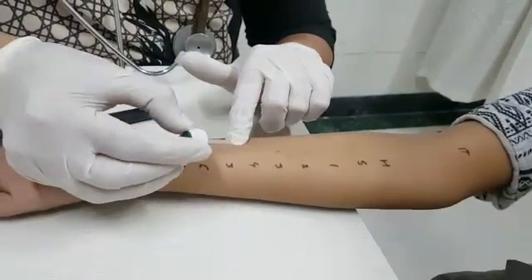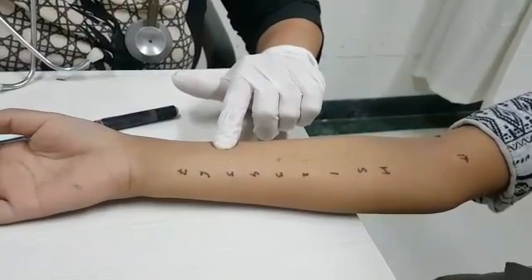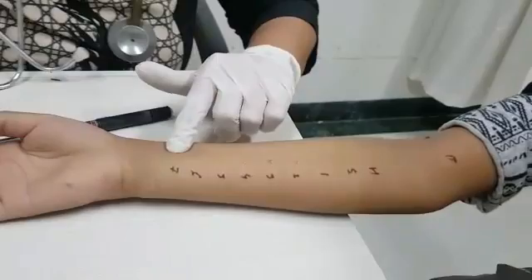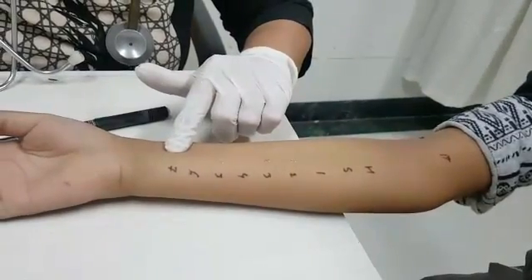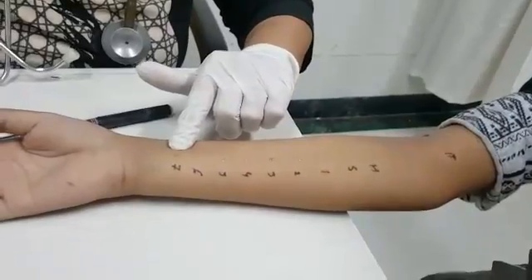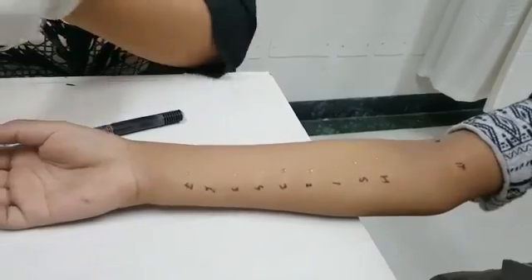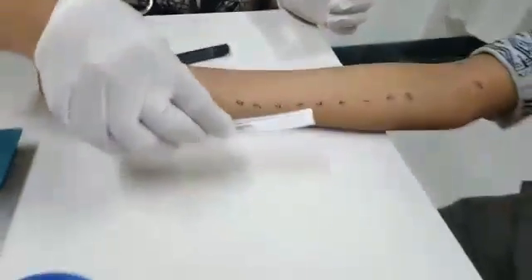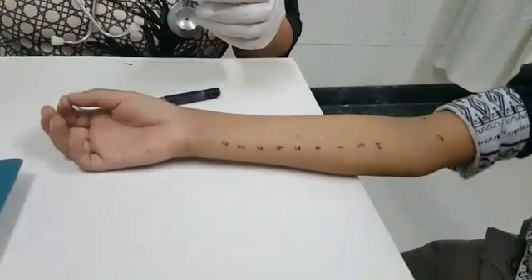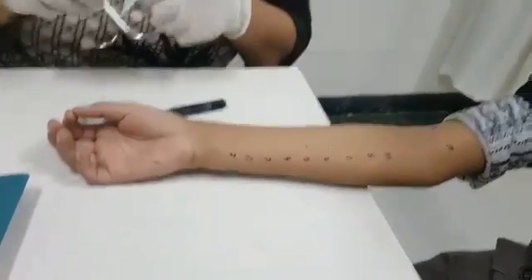We are putting the drops of allergens now. These are the small lancet needles, which we use for just touching the skin. We can also use these lancets — whichever is comfortable. I am taking this one and there is nothing to worry about.